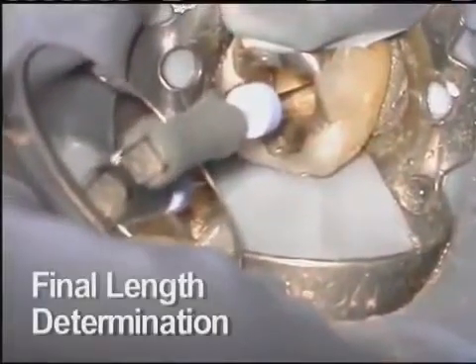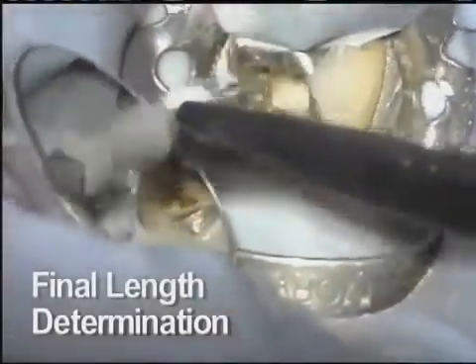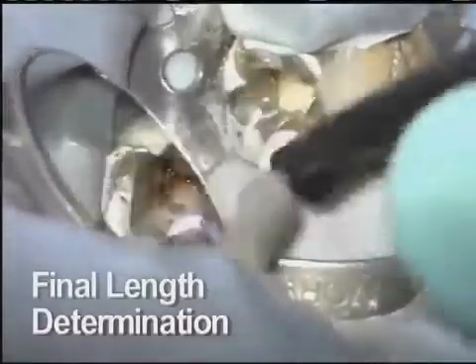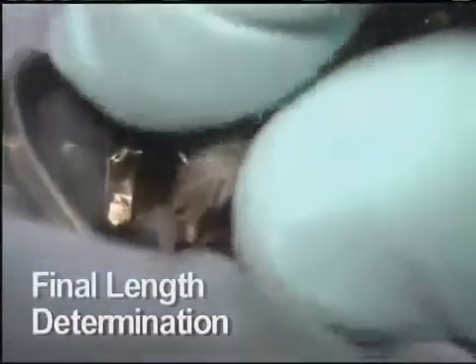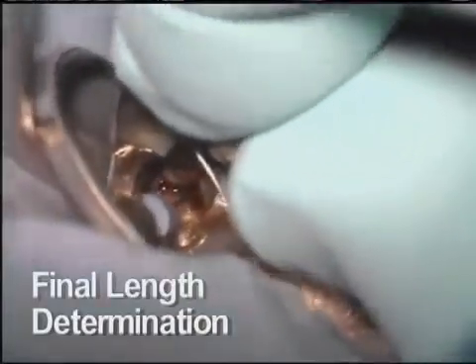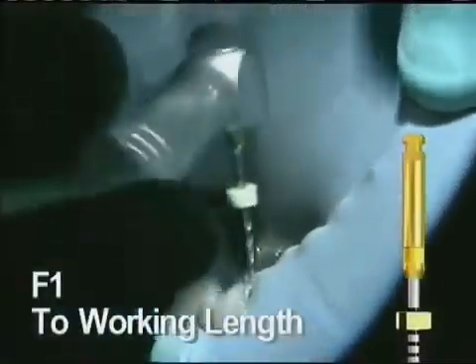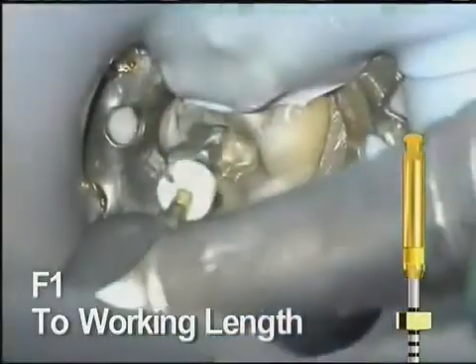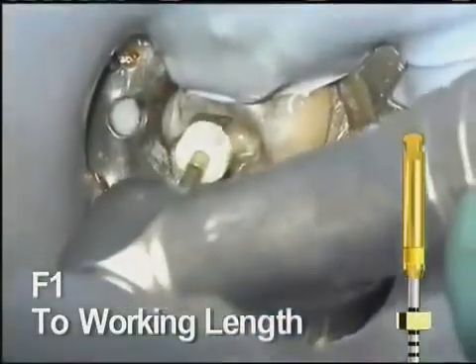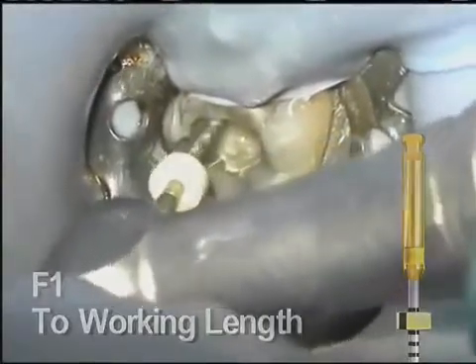Only the final apical size is still to be determined. It is often appropriate to reconfirm length determinations after principal shaping is complete. This is important because removal of obstructions in the canal will actually shorten the distance between the coronal orifice and the apex. Finishing file number 1 is taken to length. This instrument has a 20 tip and decreasing tapers. It will provide deep shape but do almost no work in the coronal portion of the tooth.